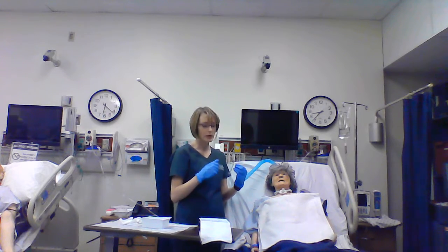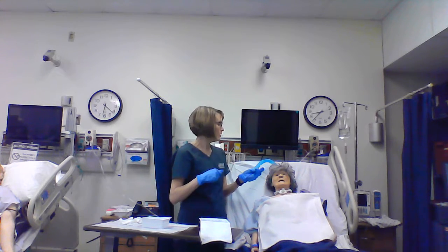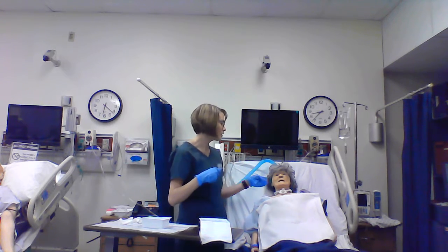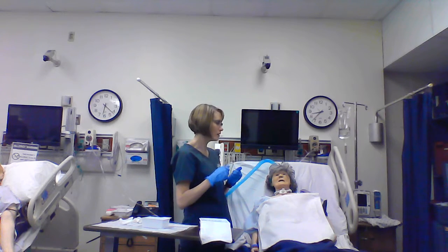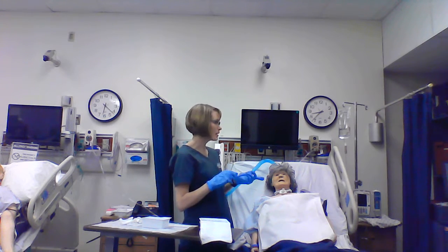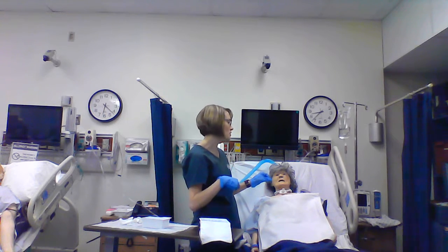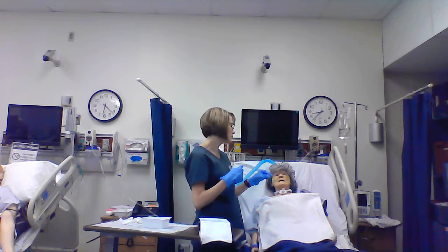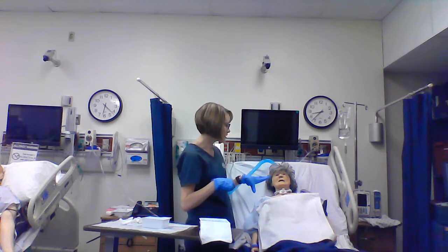So once I have her clean, I also want to assess whether or not I need to change these trach ties for her. Her trach ties are extremely clean. They don't have any drainage. They're not moist or wet. So I'm going to leave those on. But if you do decide to change your trach ties, which is always a good idea, make sure you have assistance. So have somebody come in and help you so they can hold that trach in place while you change ties. That's much easier than just doing it one-handed by yourself, but that is possible to do on your own if needed.